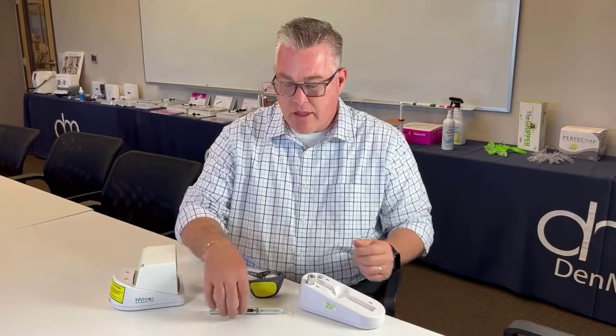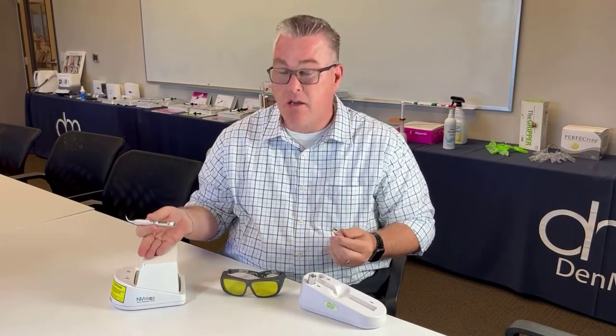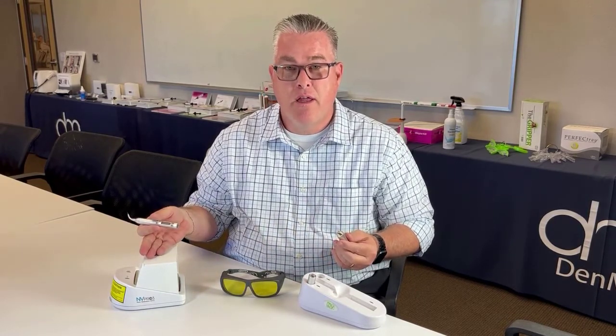Portability. As you can see with the Envy Laser, this unit is truly portable, truly cordless. The doctor can move from one operatory to the other with ease, putting it in their coat pocket wherever they may go. It does come with two batteries, easily charged, easily attached, and it comes with a wireless foot pedal — totally portable and truly cordless.